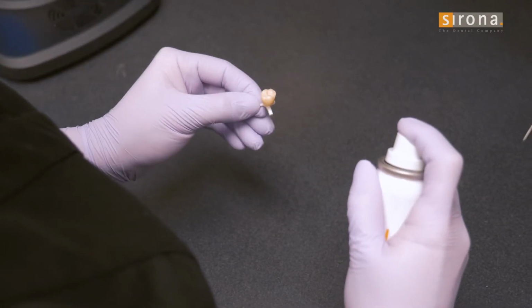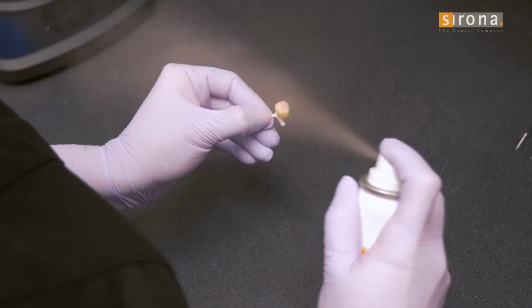And a lot of dentists are rediscovering how much they enjoy cementing crowns rather than having to bond them into place. And I know dental assistants love it too because it's difficult to clean adhesive resin cements from in between adjacent teeth. They set quickly and they set hard as a rock, and you're often in there with an explorer or a sickle scaler trying to pry this piece of cement out of there, and it's much easier to do when we're actually cementing crowns, when a simple piece of glide floss with a knot or two in it will take out any remaining cement. And that's it. That's the entire single visit appointment.